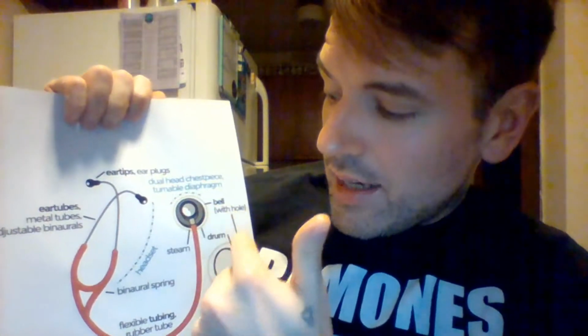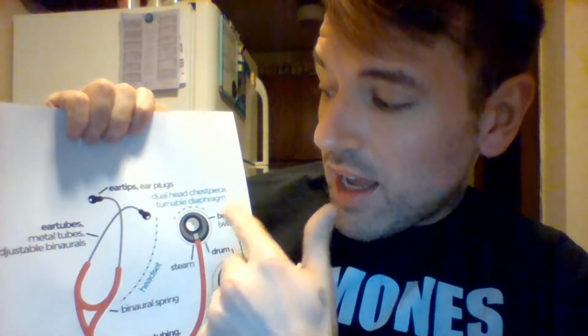One thing that's handy about the diaphragm is that it's dual-sided, as well as having a special coating on it so it isn't so cold on your skin, even though, like most of us know when we go to the doctor, when they're listening to you, it's cold regardless. It's going to be room temperature, but it apparently is better than most things you're going to put on your body.